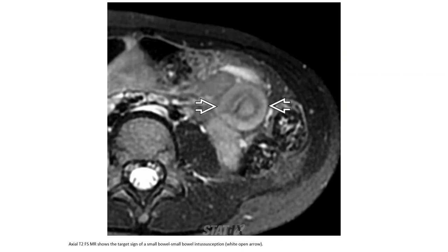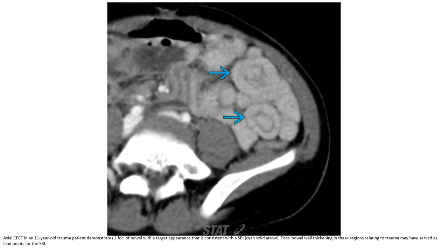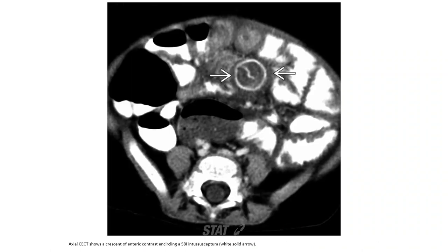CT in an 11-year-old trauma patient demonstrates two foci of small bowel intussusception with a target appearance. There is bowel wall thickening in this region related to trauma, which may have served as a lead point for the small bowel intussusception. Note the crescent of enteric contrast encircling appearance of the small bowel intussusception.